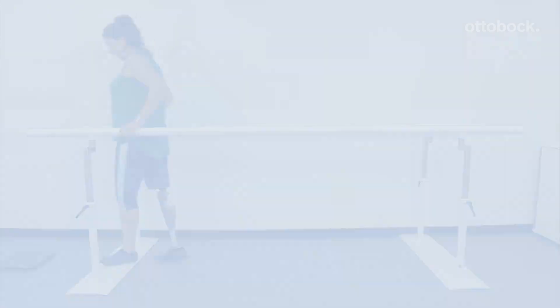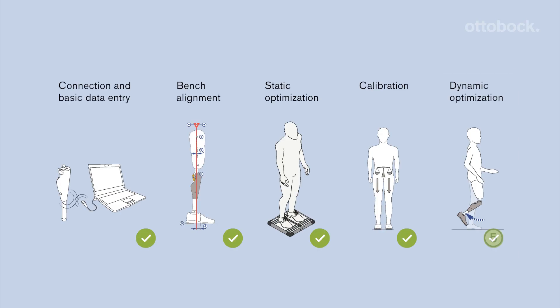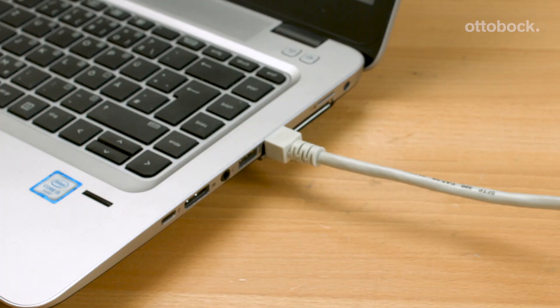For optimal function of the C-Leg 4, follow the recommended fitting process. Keep in mind that you need the newest version of C-Soft Plus to guarantee compatibility with the C-Leg 4. Connect to the internet so that C-Soft Plus can regularly check for updates.